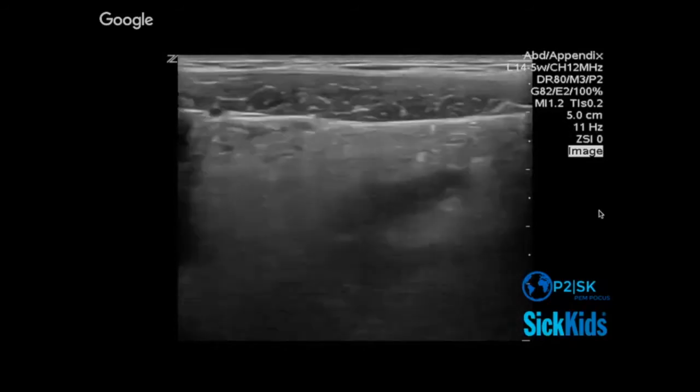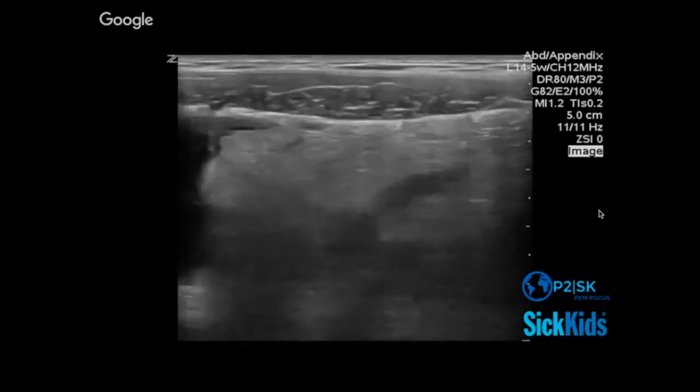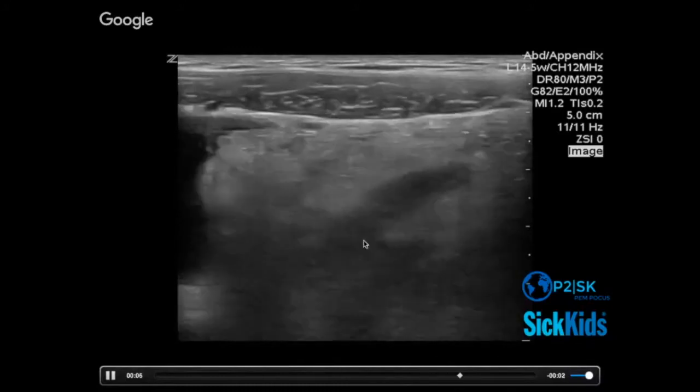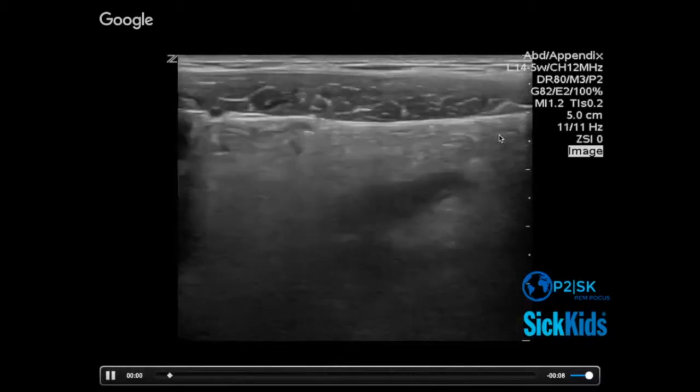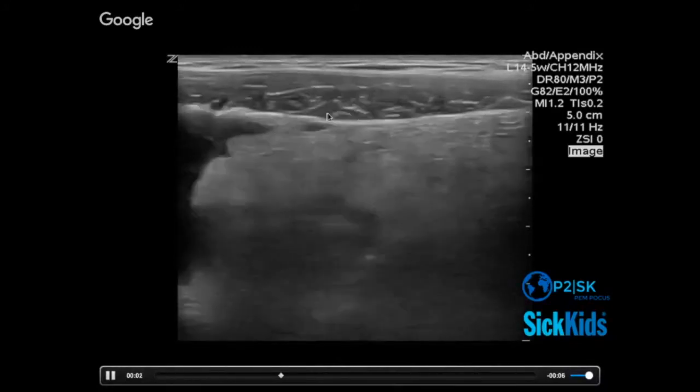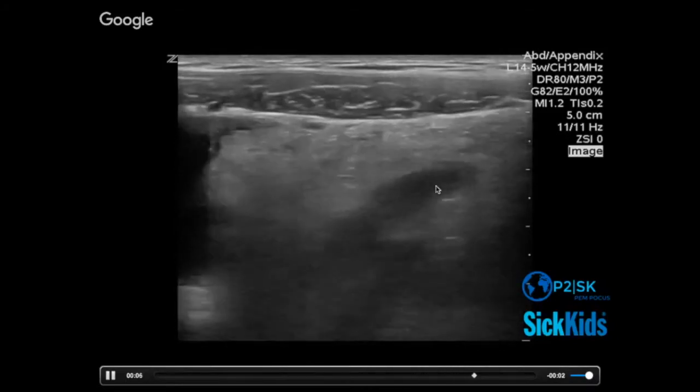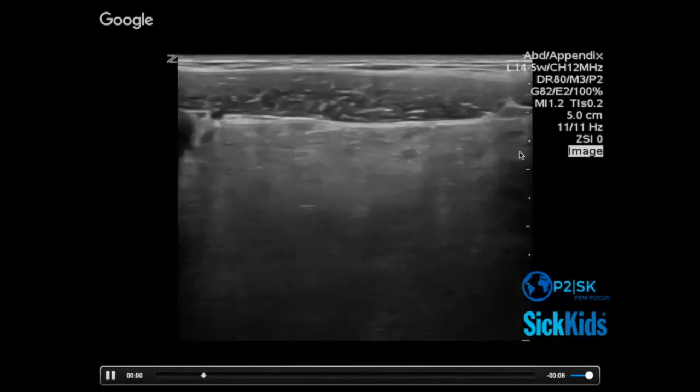Sometimes there's so much hot fat you can barely see the appendix, right? So there's our finger inside. But in teens, in the world long enough to accumulate more mesenteric fat, you can get these really impressive fields of inflamed fat.